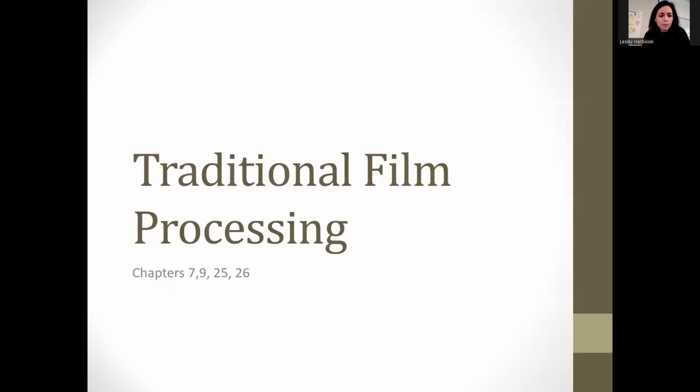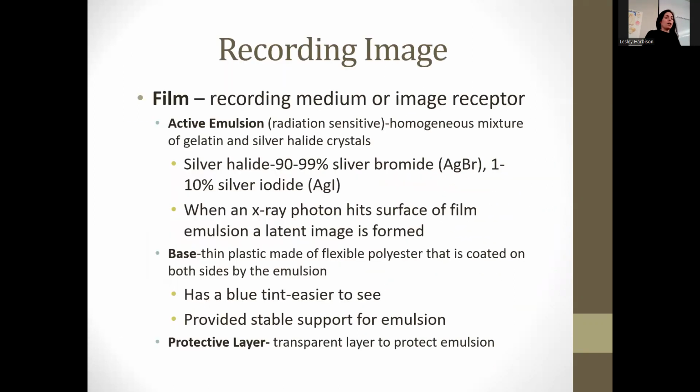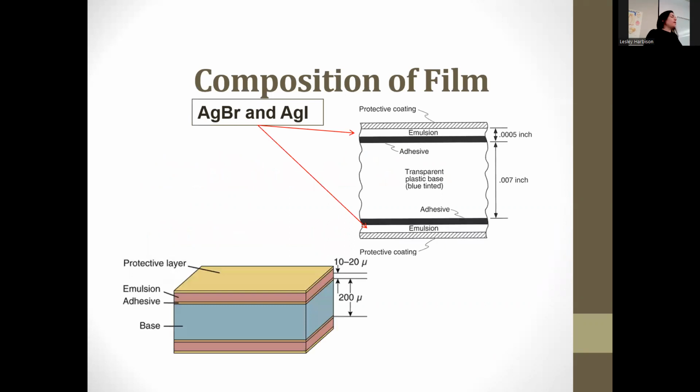Just the CBCT part, and not this whole PowerPoint that's here. It starts out with traditional. I'm just going to flip through it because I'm going to go back. I'm going to touch on this in an upcoming lab, either next week or the week after, and we're just going to review it together. I'm going to review what is in a film, what the layers are, and how the image gets captured in a very brief, succinct way.